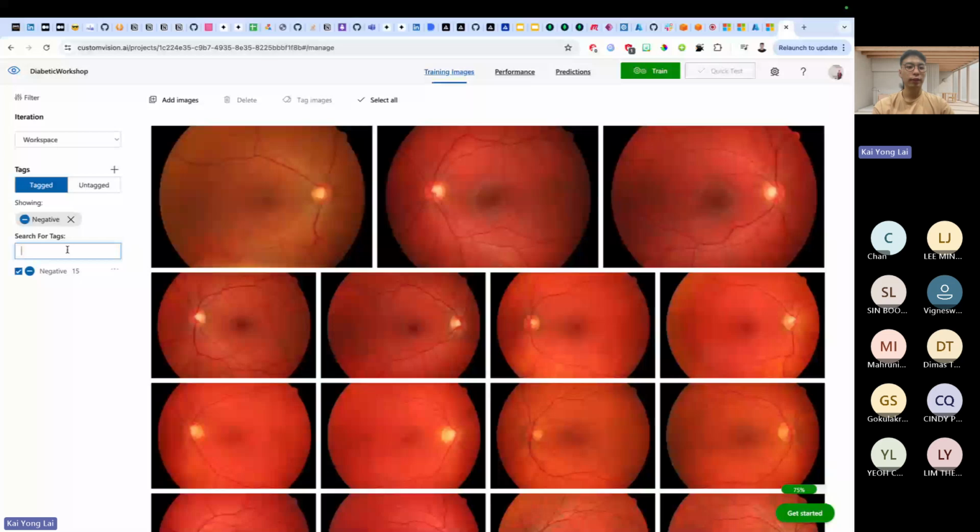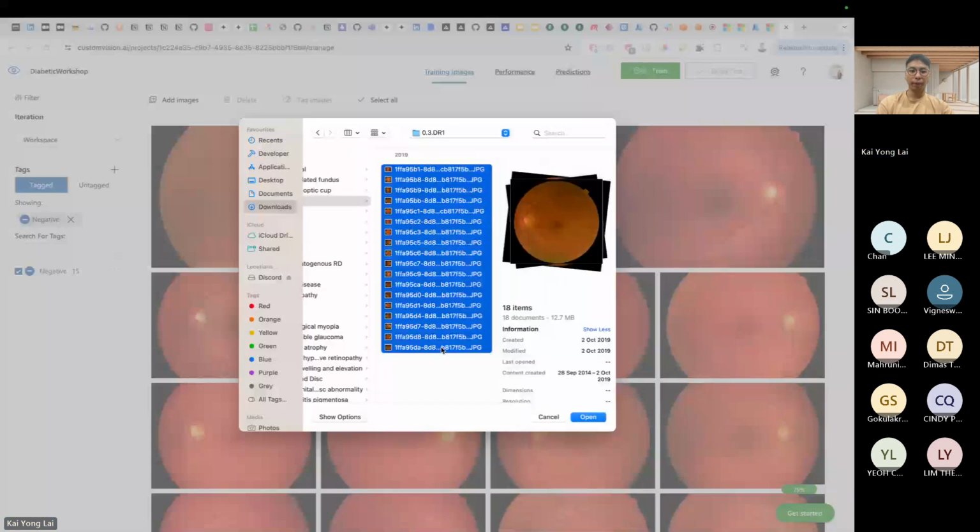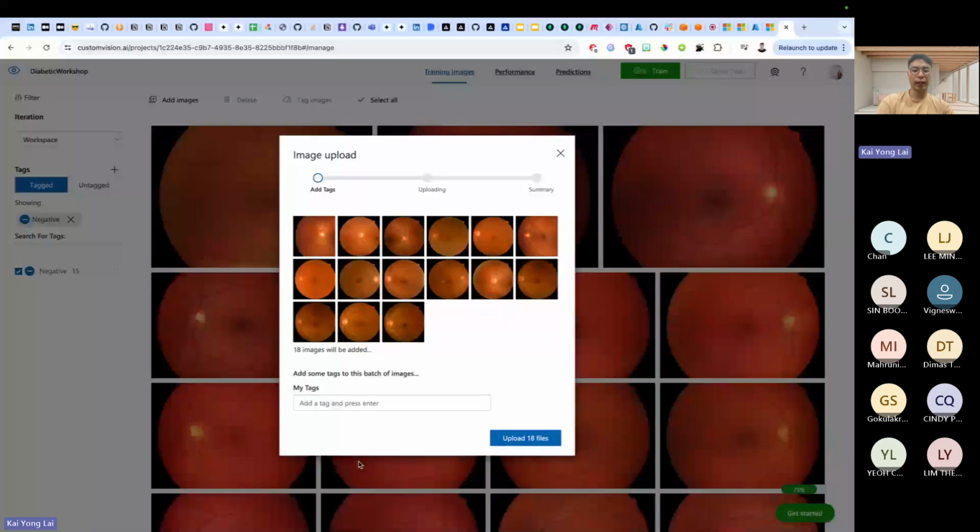Explain the data once again. So I think I will explain it through actions. Now we already have our eyeballs that are normal, which is categorized as the negative one. And we are going to upload the eyeballs that are facing the disease, right? So you click on the, I think it's the archive.zip. Once you unzip it, it will be 1000 images. Click on DR1 and upload everything that comes in the DR1. Okay, so these are positive because they are facing the issues.